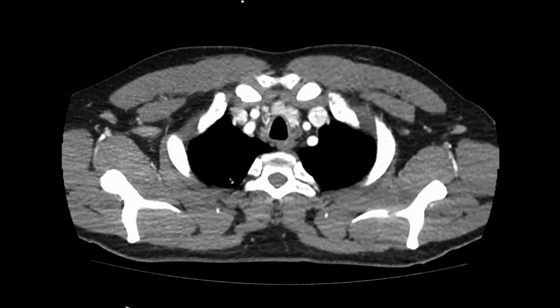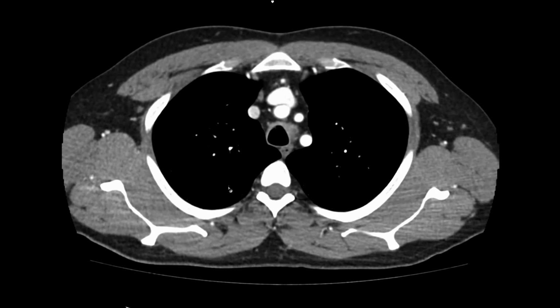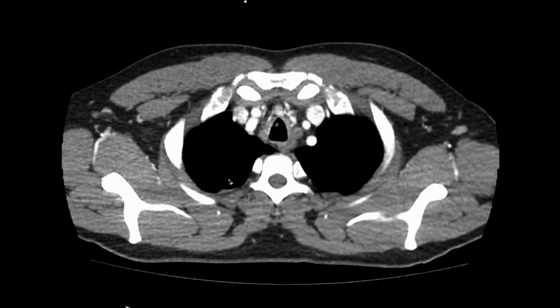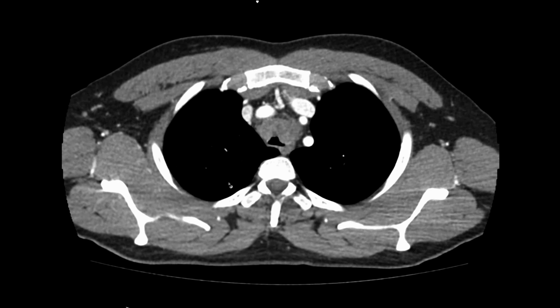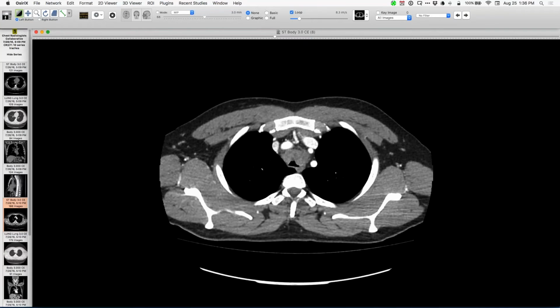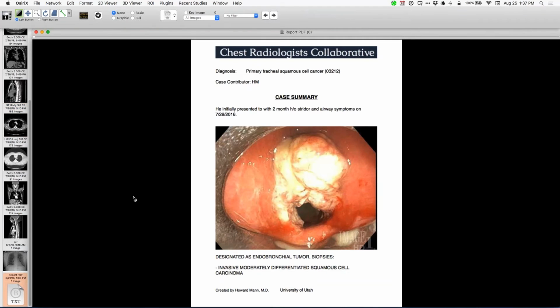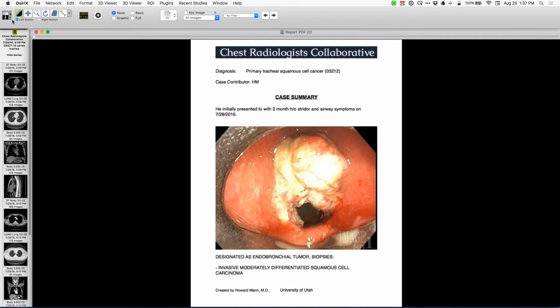And usually when I see this, I think of adenoid cystic carcinoma as my first on my list for primary tracheal tumors. But of course, there are the others, the squamous and the mucoepidermoid as well, on the top of that list. And this one turns out to be a squamous cell cancer. Really looks nasty, as you can see there. So they're trying to decide what to do about that, how to resect that. Is it a long length? Can they resect that and still do an anastomosis? So that's up in the air. But pretty unfortunate person with a really bad squamous cell tumor in this case for that tracheal lesion.